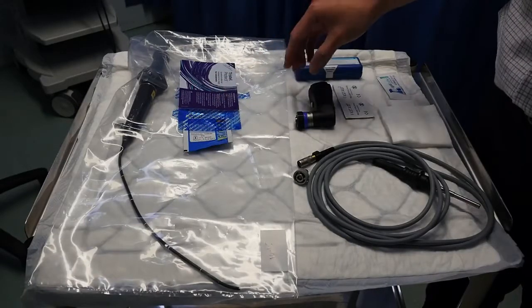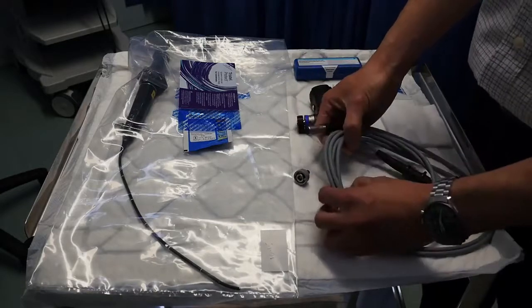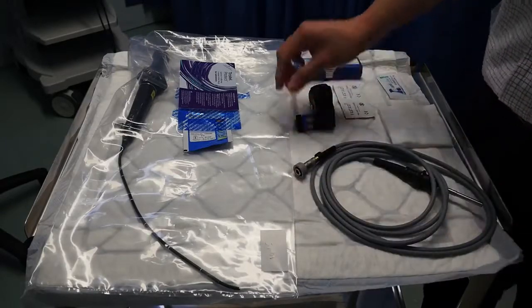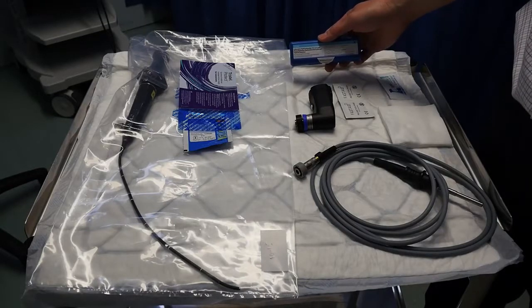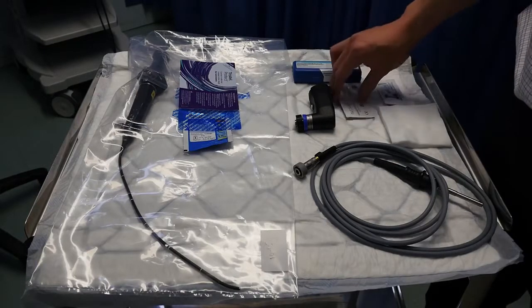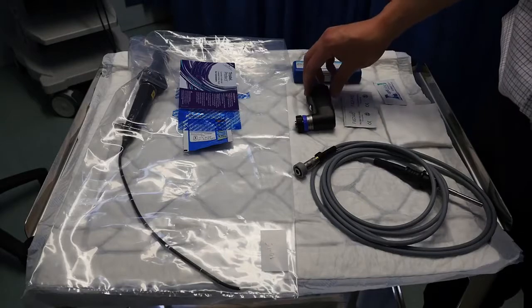The next thing we need to do is we need to have a light source, and we've got two options. Either we've got a battery pack or we've got a cable. And for the cables, it's important for you to make sure that we've got the right attachments for the cable to fit to the scope. We also need to have some decongestants and a local anesthetic, and here we use lidocaine and phenylephrine. We need some lubricant, a water-based lubricant, and some alcohol swabs to keep the tip of the scope from misting, and just some general swabs and sometimes some tissue paper for the patient.